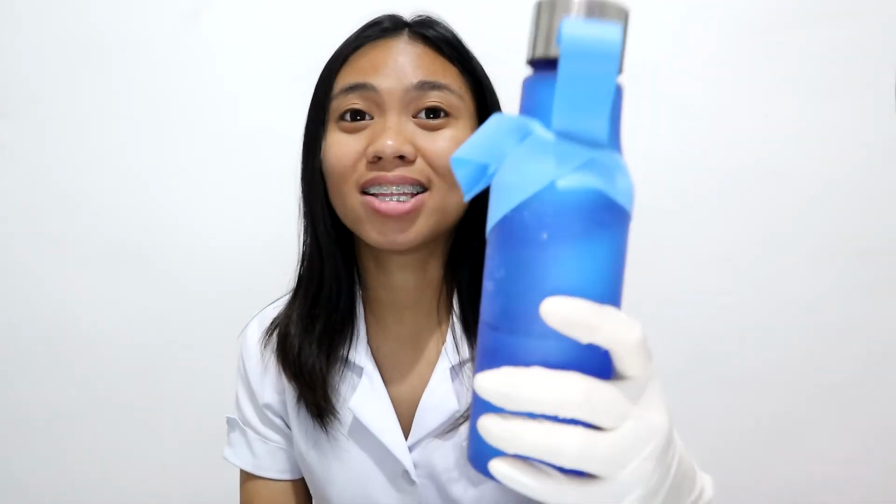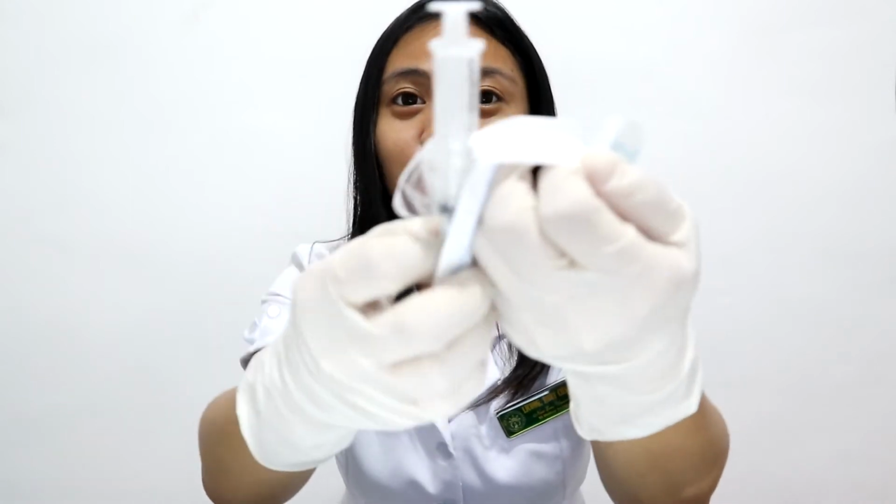After cleaning the area where you will do the venipuncture, we can now put back again for the second time the tourniquet and prepare our syringe. So this is our syringe. We must prepare it first.